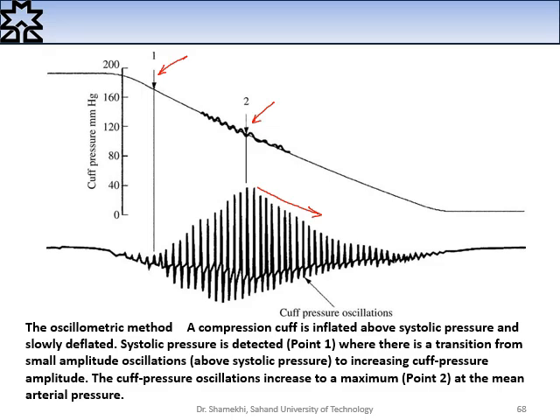and after complete reduction of the applied compression of the cuff, we should be able to find the location 3 to find the diastolic pressure, but because of the extra vibration of the wall of the vessels, we cannot find the exact location of point 3.